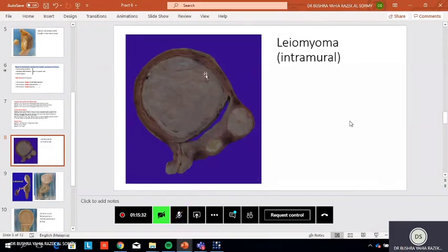Enlarged, or is there a tumor here? Tumor necrosis. Can you see the tumor there? It has compressed the myometrium. We said the benign tumor is growing by what? By compression of the normal tissue, right? This is the same thing. It is growing by compressing the normal tissue.